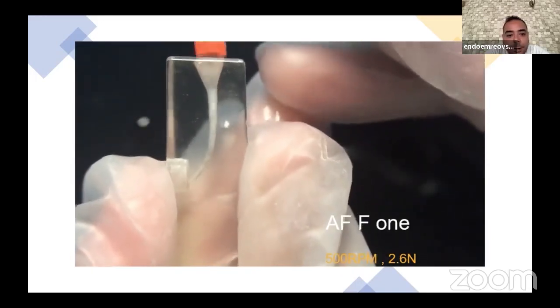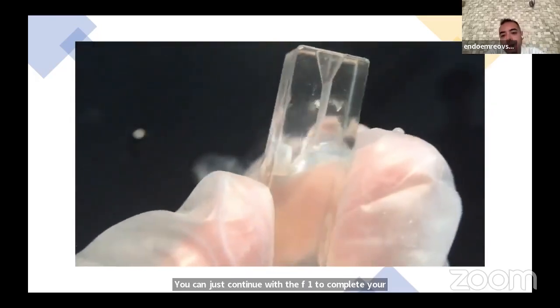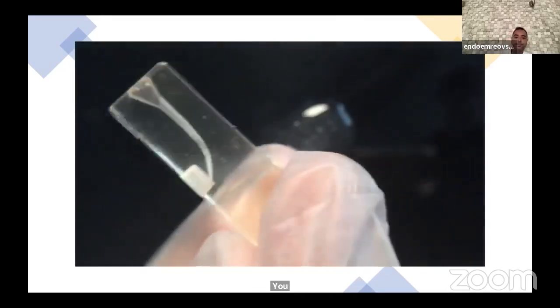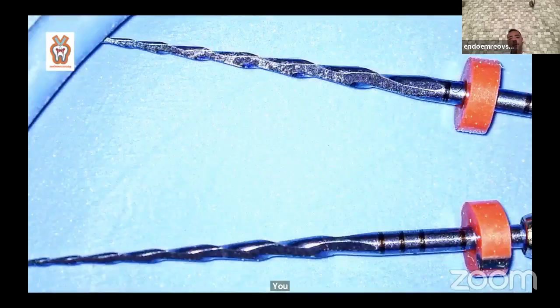You can just continue with the F1 to complete your shaping procedure easily, and you can finish your cases for your application.